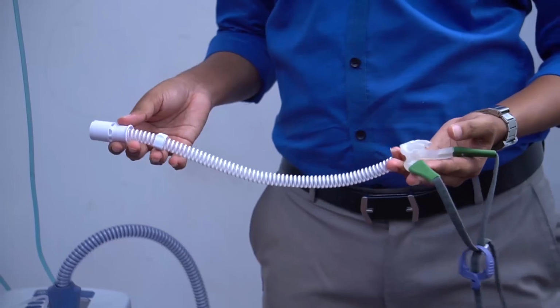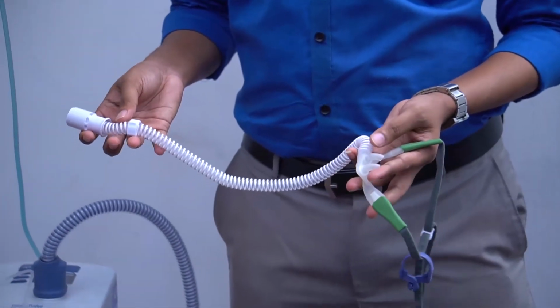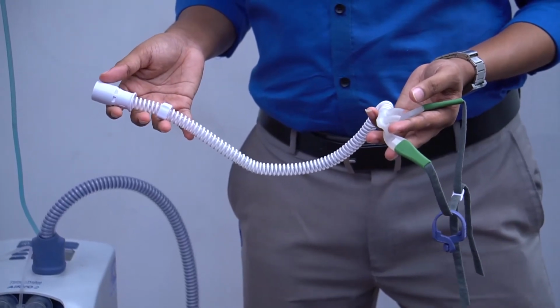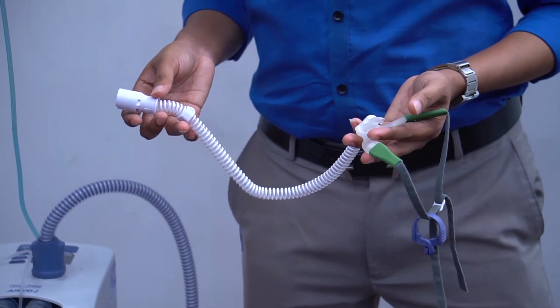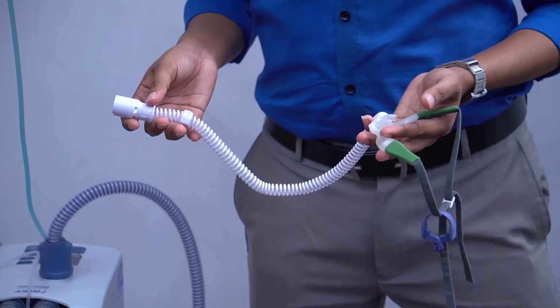High flow oxygen delivery needs a nasal cannula. Generally it comes in 3 sizes: small, medium and large. The appropriate nasal cannula should be selected according to the patient. The nasal cannula is placed into the patient as follows.